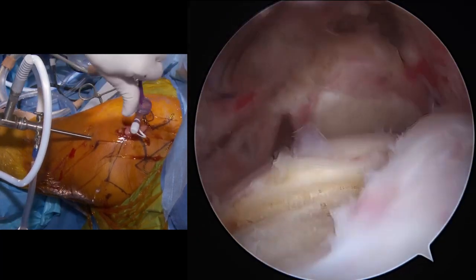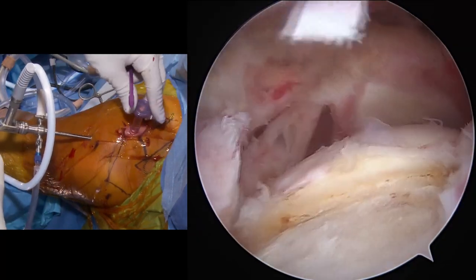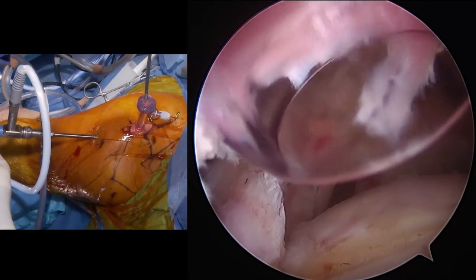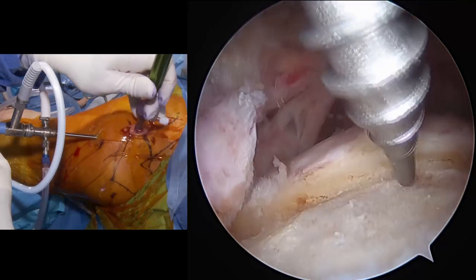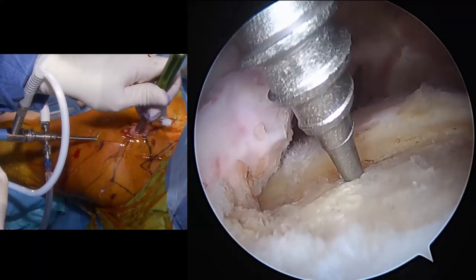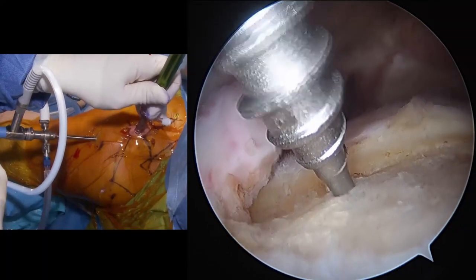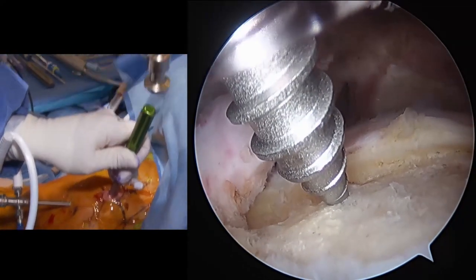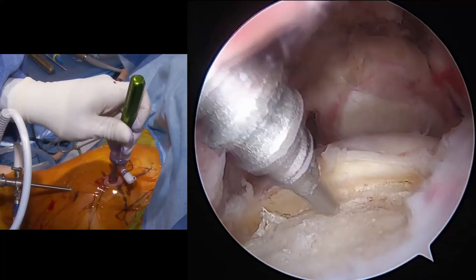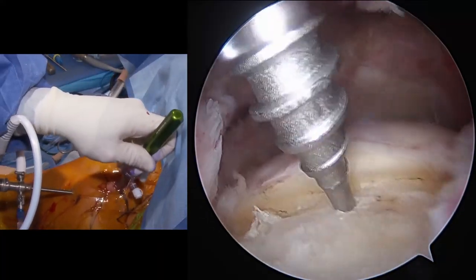Okay, so we prepared the tuberosity. Now we're going to take a mallet, please. Debbie, just tap this gently. Just one at a time. We just want to go down to the little, so just watch the screen, hit it. Keep going. We go all the way down to the first one. Okay, stop. So we're going to put some holes in the bone here to try to improve our blood supply.